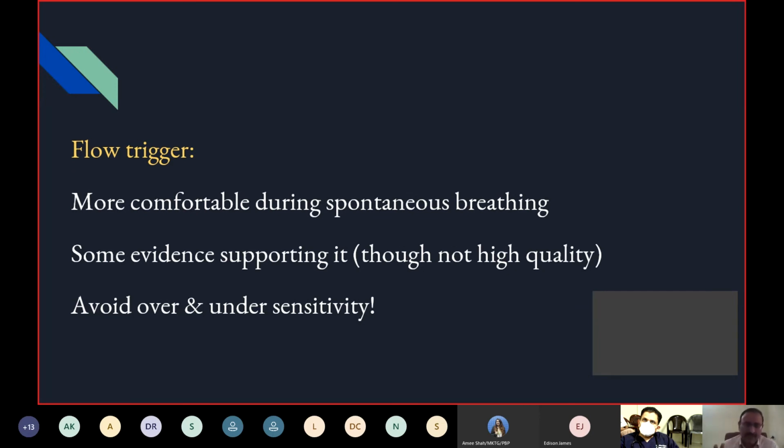Now, an ideal flow trigger is supposedly around 2. Why 2? If it's more than 2, you should understand this patient is on the ventilator, probably the muscles are not that great, and you're asking the patient to take a deep breath to take that flow in. That might increase the work of breathing, might tire the patient, and again won't be synchronous. The patient won't like it.